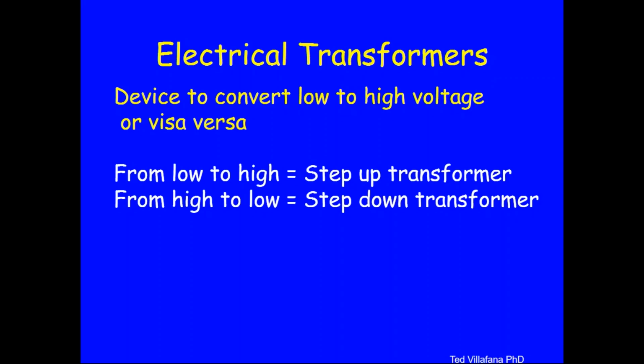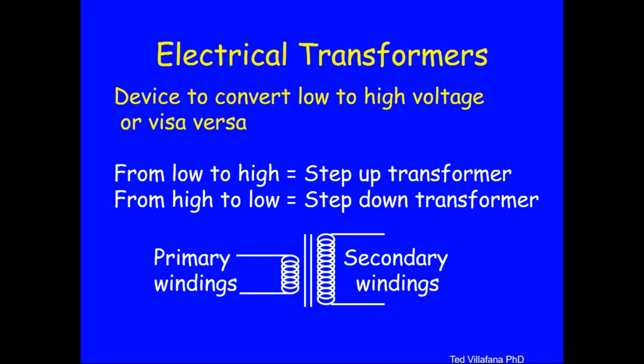But in radiology, to power a filament, to get your thermionic emission, to heat up a filament in an X-ray tube, that doesn't take 110 volts. That takes more like between 6 to 10 volts, not 110. So you've got to power down the voltage out of the wall down to the levels that are used to power your filaments.